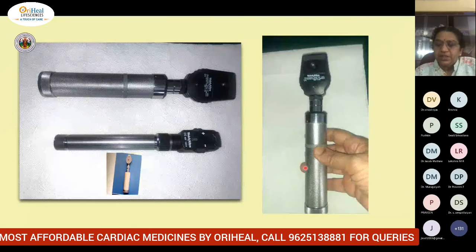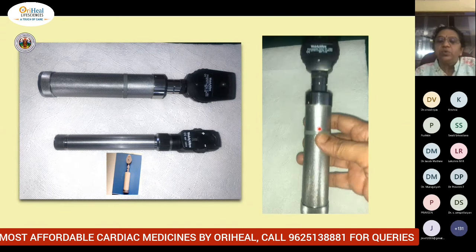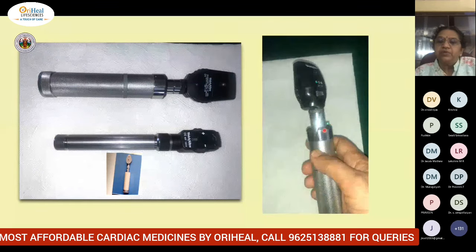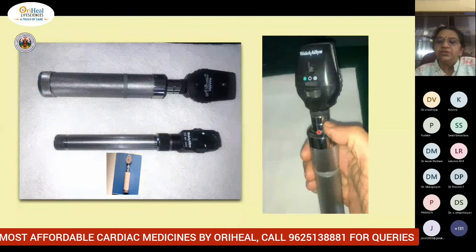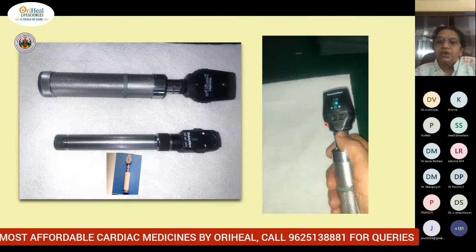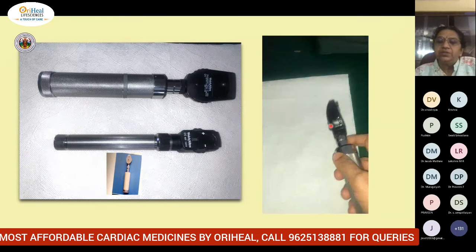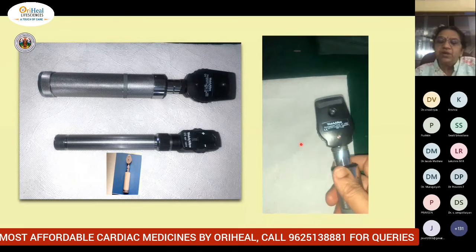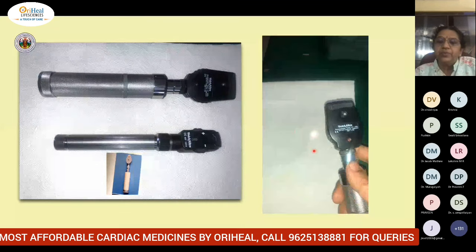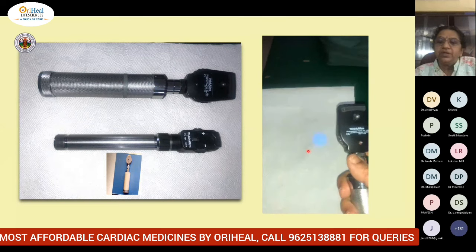It's a direct ophthalmoscope, which we actually saw in module 1. You have the on and off switch, so you have to press that and then turn around. That is how you switch on the machine. You also have different types of filters here. This is the circular dial. As you turn it, you will get different types of apertures and different colors.